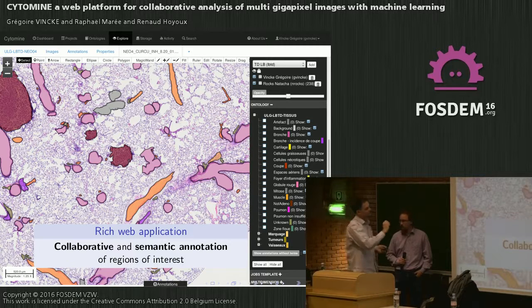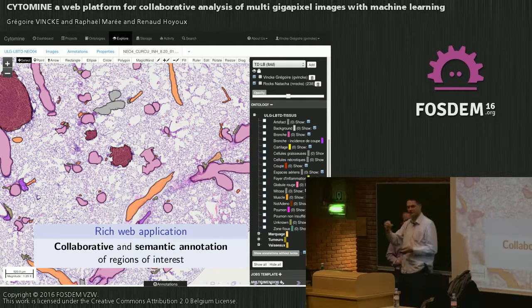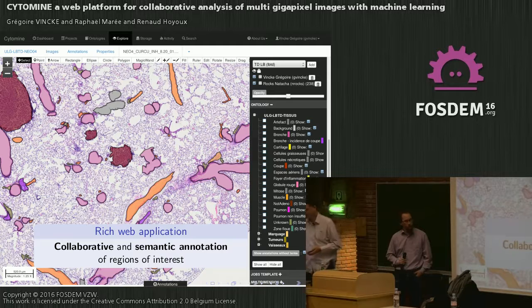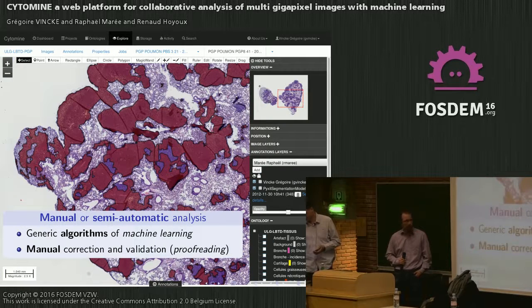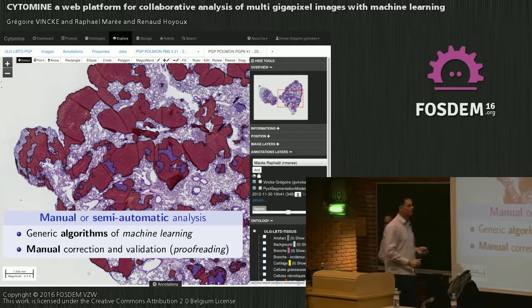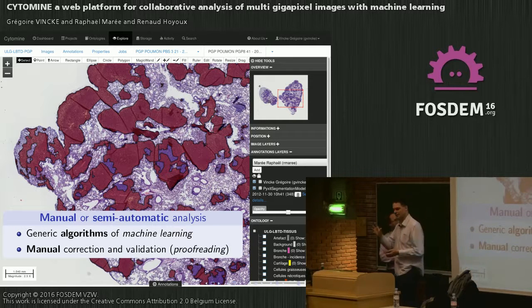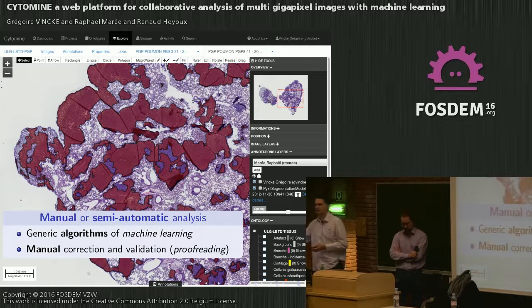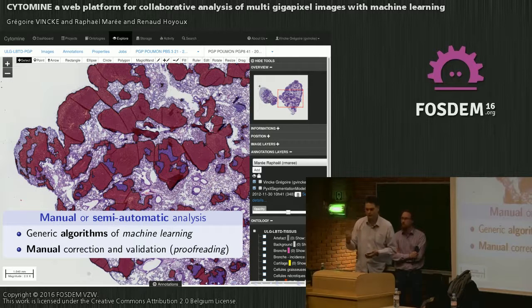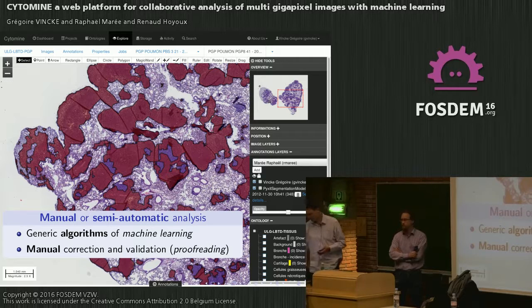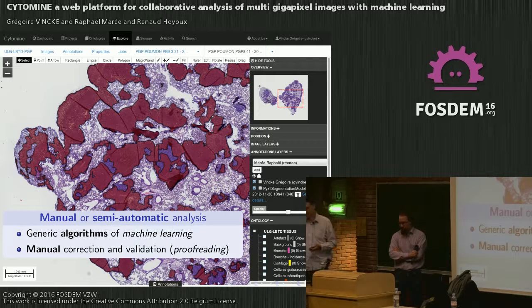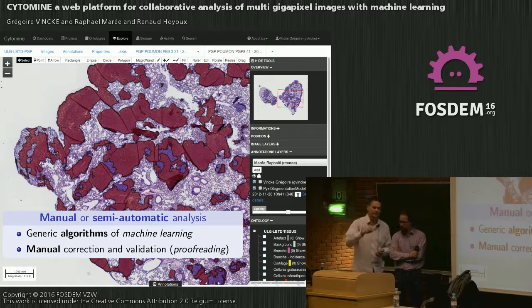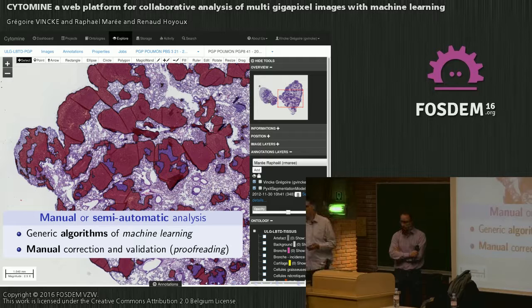When an annotation is linked to a keyword, each keyword has a color and the annotation takes that color. So a colleague or clinician can easily see what you have annotated and why, and make corrections if necessary. The first goal was to build a tool for machine learning. When you set annotations, you tell the computer what structures to recognize inside the image, including what looks similar but should not be detected — so you have positive and false positive samples. You do comparison and matching learning so the computer can detect and annotate at a larger scale. There is also a system for humans to correct what the software detected, to achieve a high level of accurate detection.